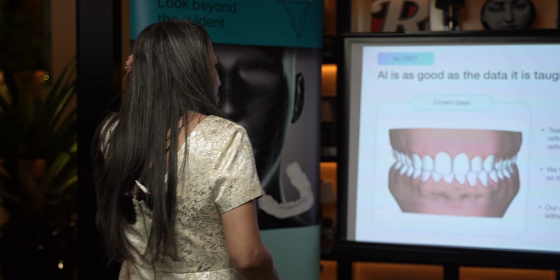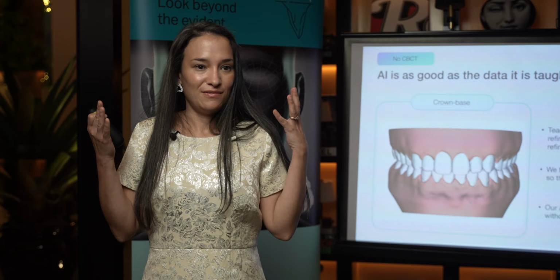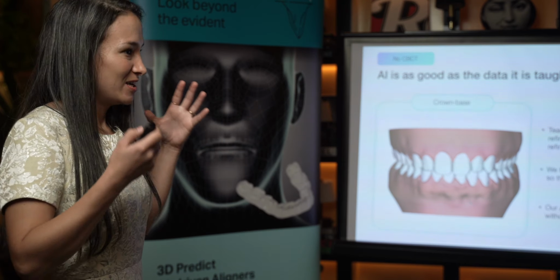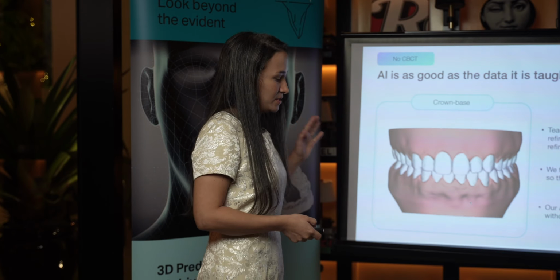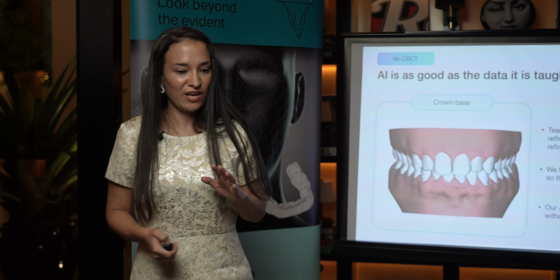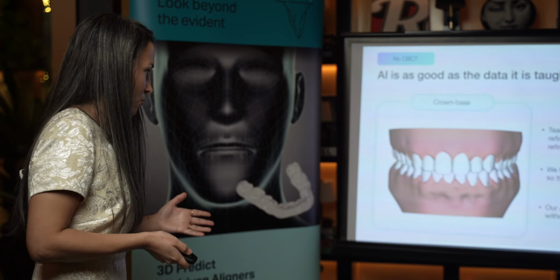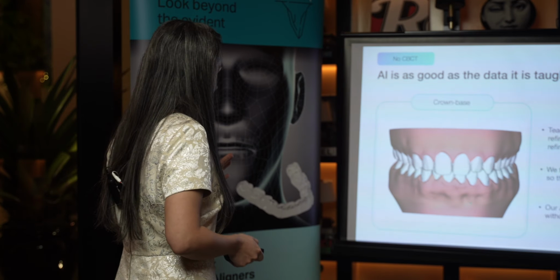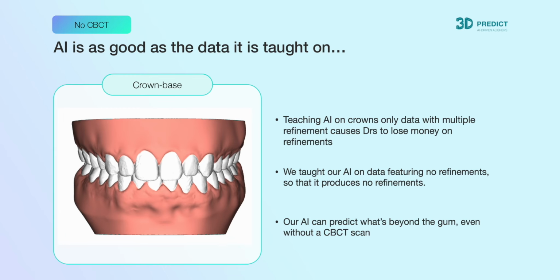Now, let's just focus a little bit on when CBCT is not needed, right? Once again, you can submit any case without CBCT, any case. You can't just tell patients you're going to be taking CBCT left and right. No. A lot of patients are not going to accept that either. But if we see a case that really needs CBCT, we will let you know.